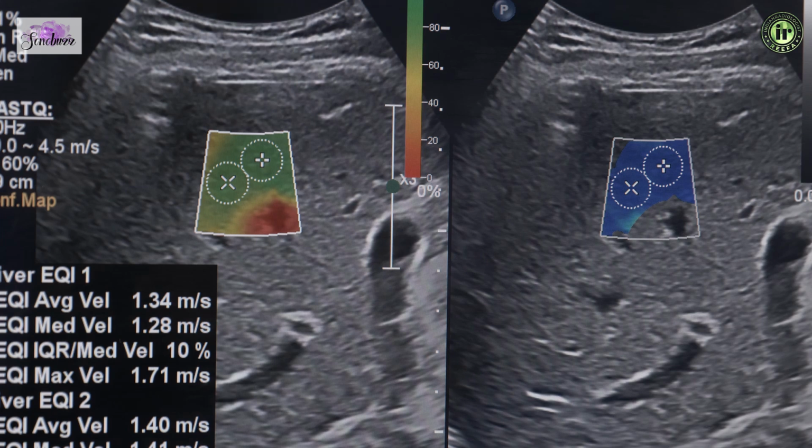But then that means you have to ask the patient to breath hold for a shorter while, and you can take more measurements. So this is especially advantageous in patients where the breath hold is a big problem, like for example those who are admitted, and quite a few of the indoor patients, you have a lot of difficulty asking them to breath hold. Some of the elderly patients, especially in pediatric age group, this problem is a huge problem. It's very difficult to ask them to breath hold.